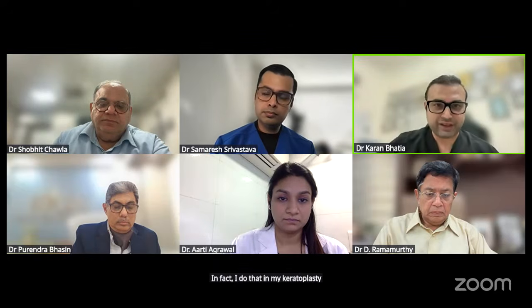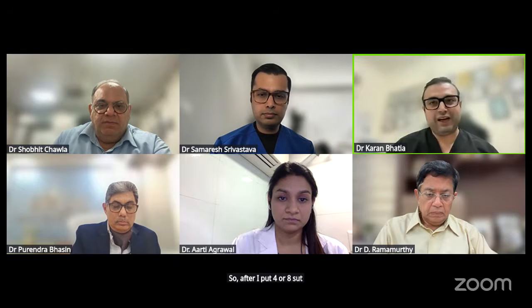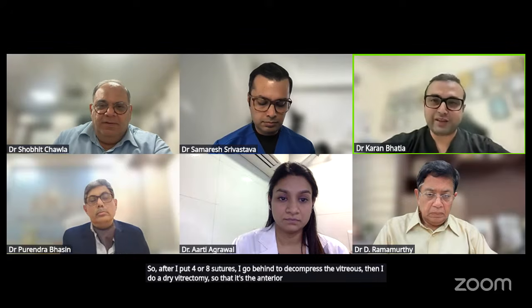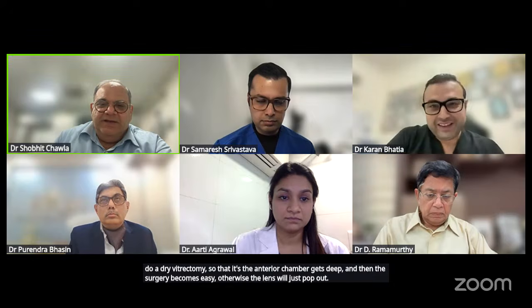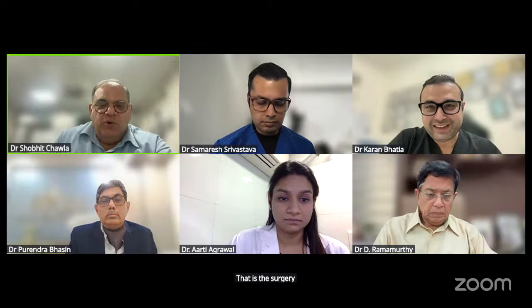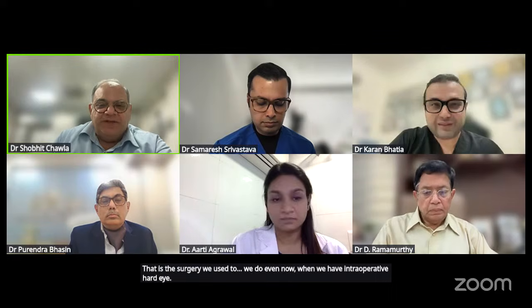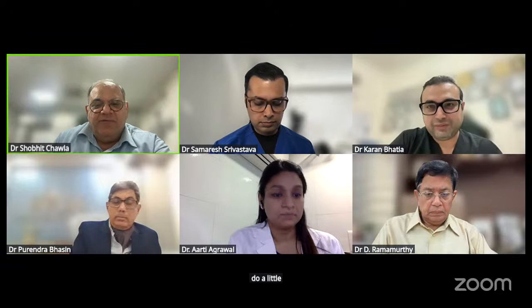In fact, I do that in my keratoplasty cases also when there's an upthrust. After I put 4 or 8 sutures, I go behind to decompress the vitreous. Then I do a dry vitrectomy so that the anterior chamber gets deep, and the surgery becomes easy. Otherwise, the lens will just pop out. That is the surgery we do even now when we have an intraoperative hard eye. Not an expulsive, but an intraoperative hard eye. Just go ahead with a 25 gauge, do a little dry vitrectomy and go ahead with the procedure.